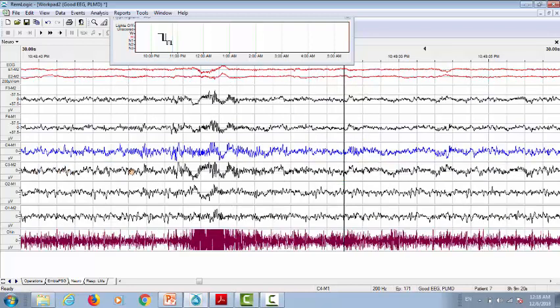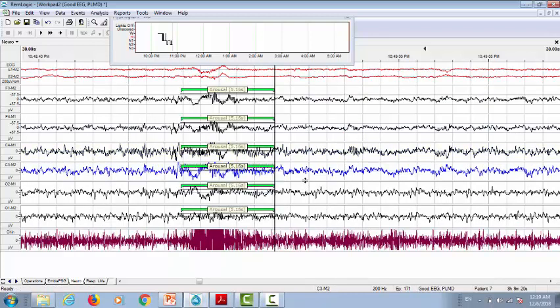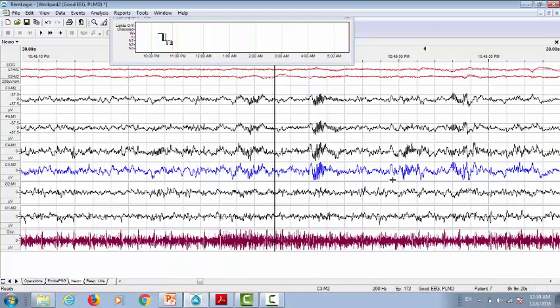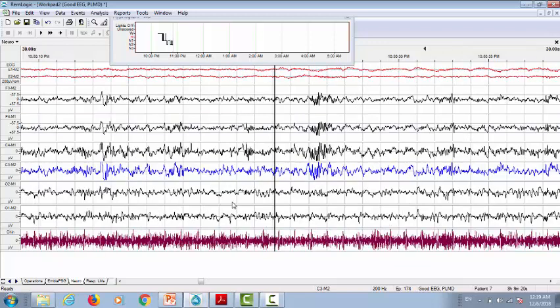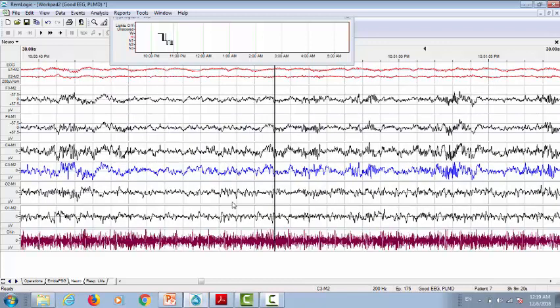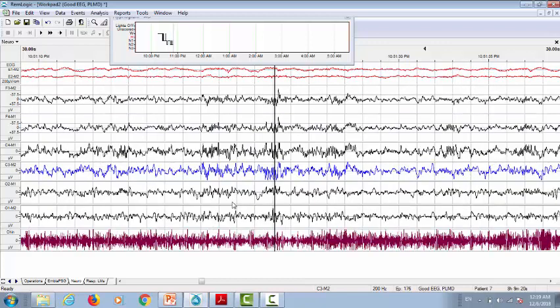So this part is N1, and we have another arousal, and the remaining part following the arousal has theta, so this is N1. Spindle in the first half of the epoch, so this is an indication for N2. Continue to score N2. No reason to stop scoring N2.